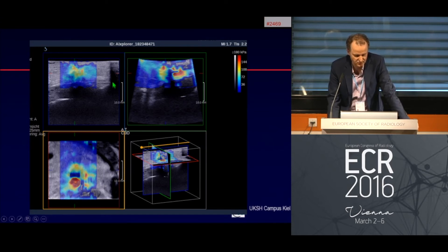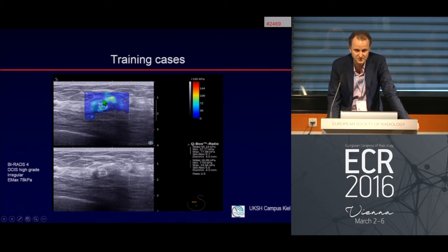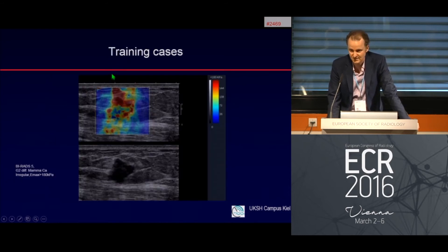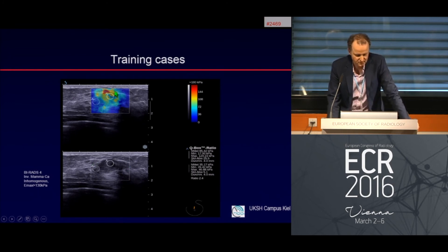Another case: a small architectural distortion, hypoechoic, BI-RADS 4 finding, corresponding with very stiff regions of orange-yellow-turquoise color — a pattern 3 finding — this is high-grade DCIS. Classic cancer: a hypoechoic spiculated lesion corresponding with red, very heterogeneous color. Another case with a fairly well-defined lesion shows blue-orange color, very stiff — also a cancer.